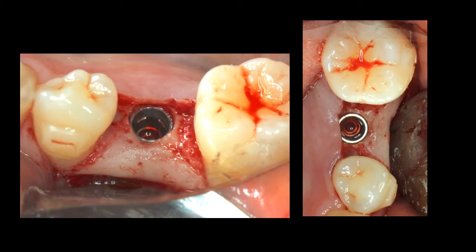Finally, the implant was placed because we were happy with the positioning. The implant was placed 0.5 millimeter subcrestal in this location. As I said, different dentists prefer different protocols, whether subcrestal or at the crest level. Some implants actually have a polished collar that needs to be supracrestal. But in any case, the positioning of the implant is adequate.